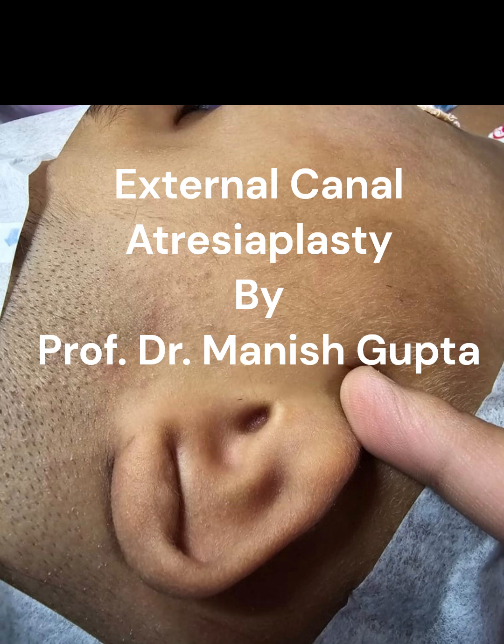Hello, I am Professor Dr. Manish Gupta. The procedure we are showing here is for external canal atresia and treatment, that is atresiaplasty.